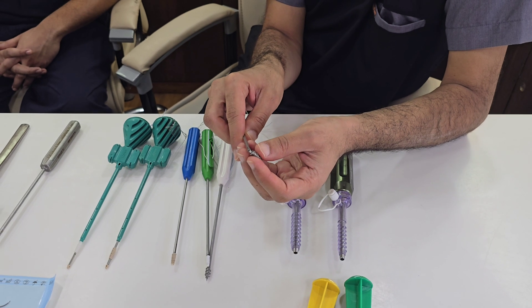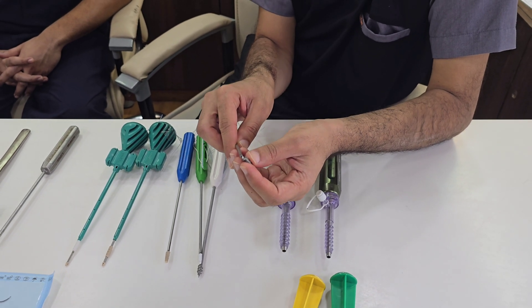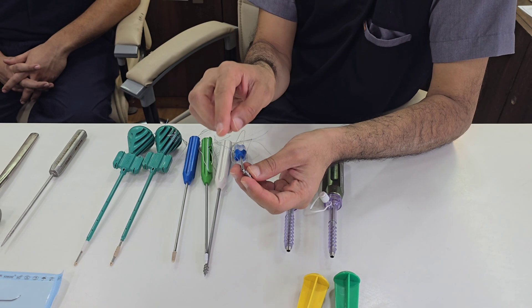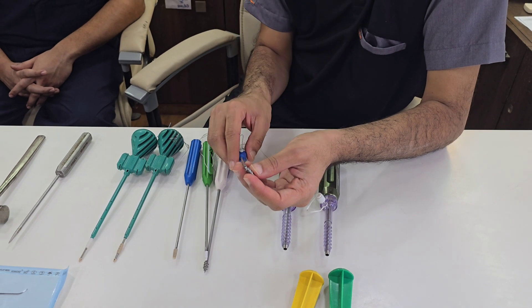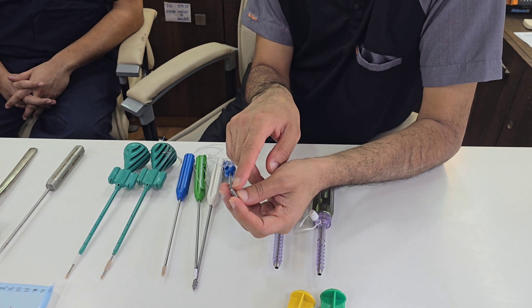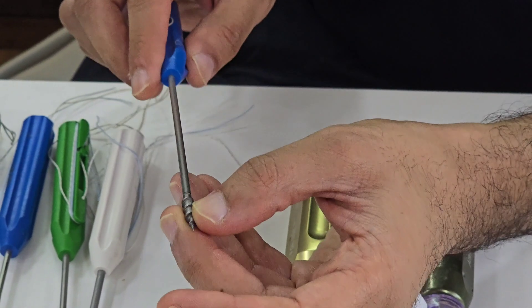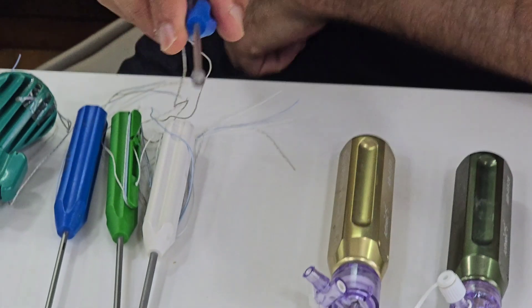This is one of the preferred options if you are using a metal anchor. If you are using a metal anchor, avoid anchors with an eyelet. We strongly recommend anchors without an eyelet, where the wire is coiled up to the base of the anchor. That covers the metallic anchor option.